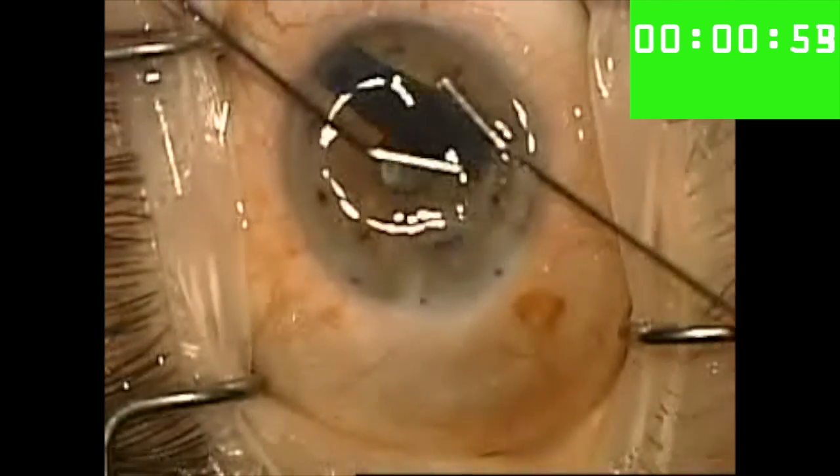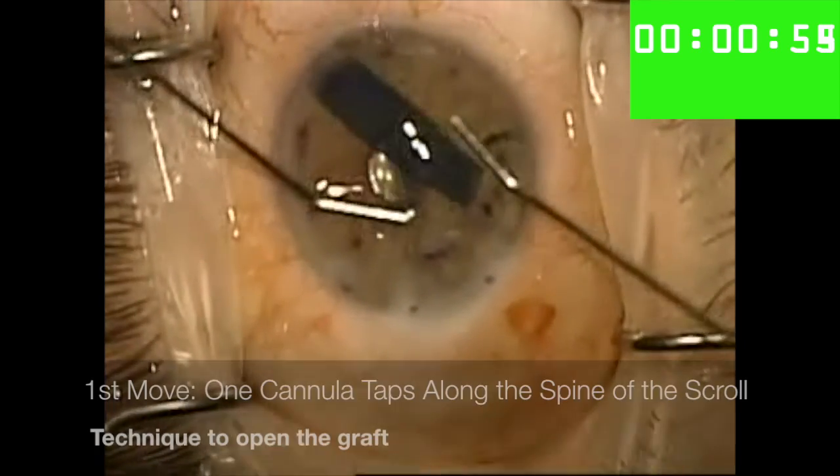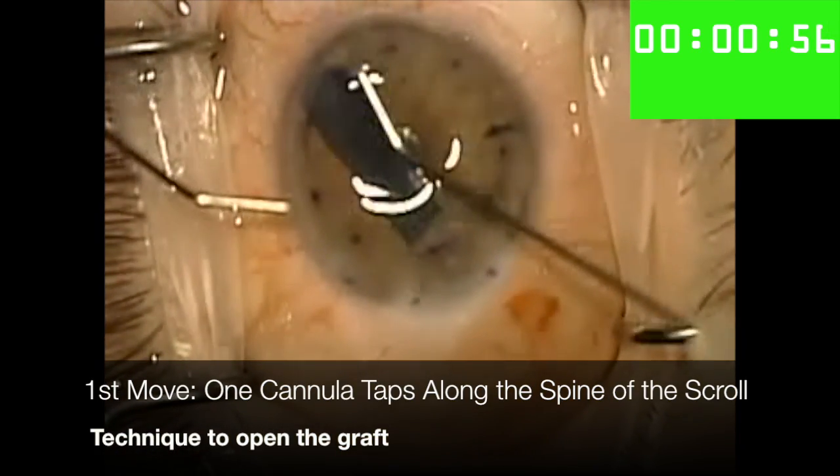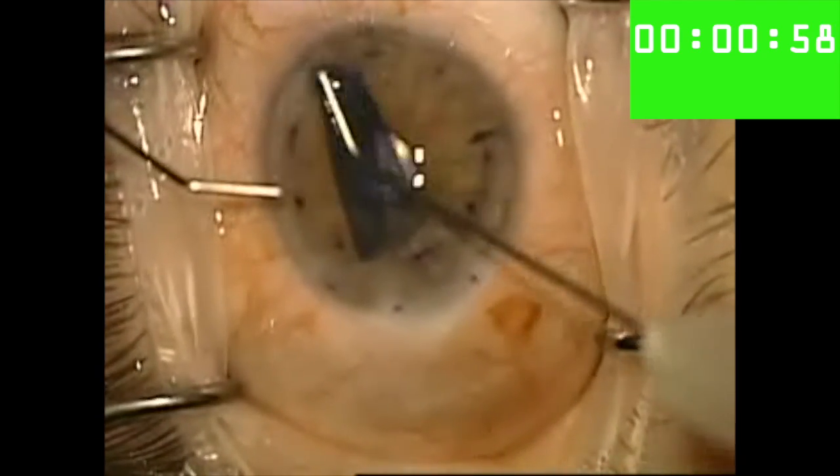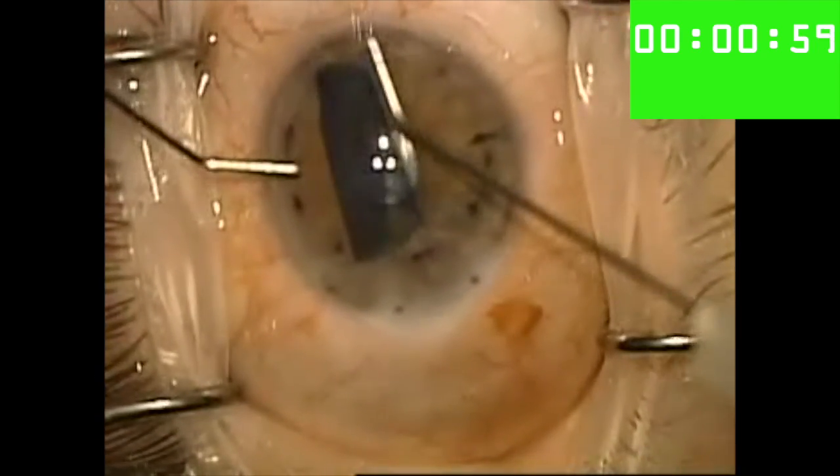I then tap the other end of the scroll and it begins to respond by opening for me. At this point I tap down the spine of the scroll, central to both unfurling leaflets.